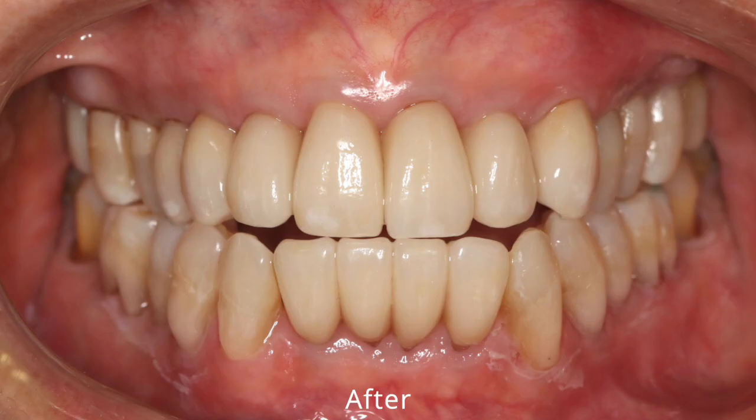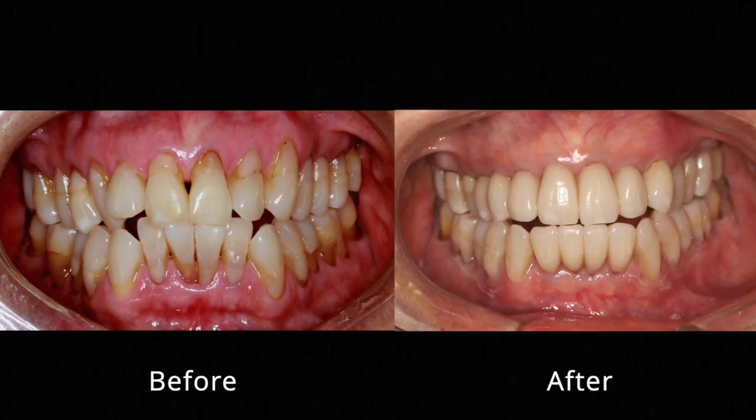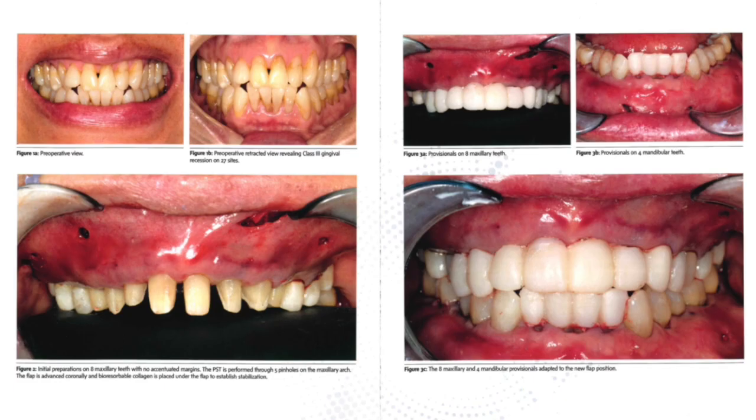'Can you do it for me all in one visit so that I can look good right away?' So this is what we ended up doing — this is the before, this is the after. This is the final impression nine months later, but let me show you now how we went about doing this. If you're a patient, this is what you go through. If you're a doctor interested in how this is done, let me walk you through very rapidly.